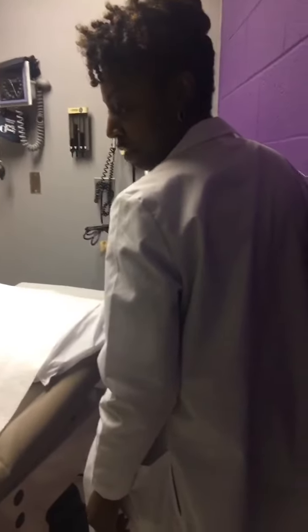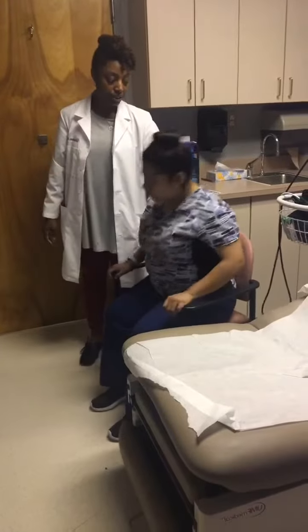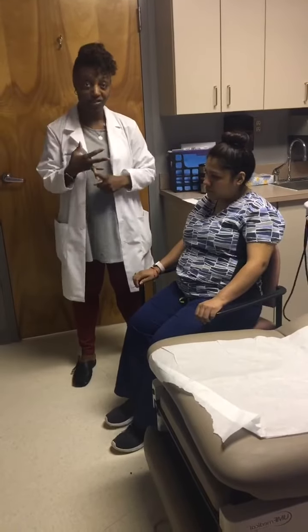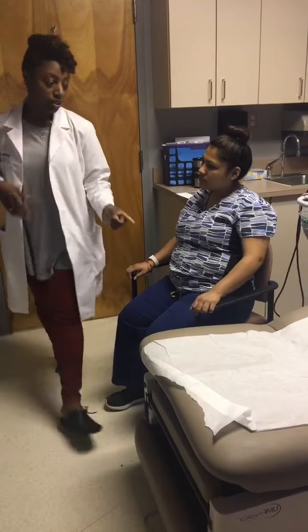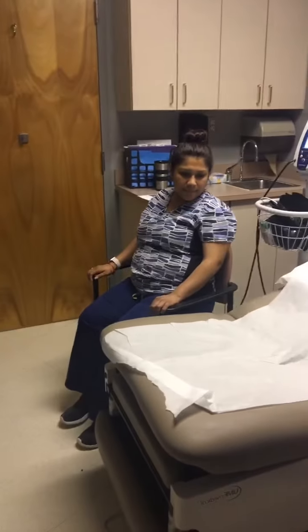So what you should do — we're going to put you down. Whenever you're going to get your blood pressure checked, ideally you would be seated in a chair that has a back, because you want your back to rest. You would be resting for about five minutes — that's no talking, no cell phone, no trying to get your kids to sit down. You need to be in your exam room before the provider comes, particularly resting. You want your arm to also have a rest; ideally it's at the level of the heart. So we're probably going to move this table back up a little so you can put your arm up on the table.